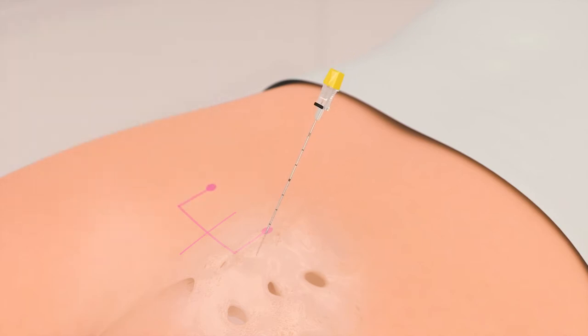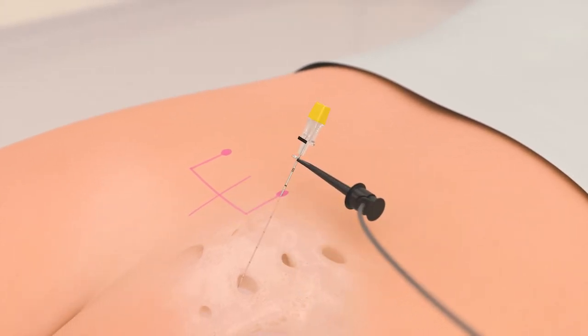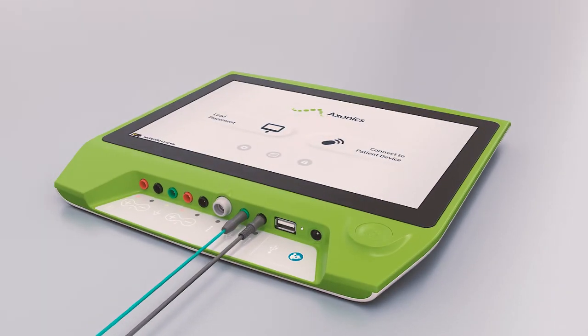Once the foramen is accessed, advance the foramen needle slightly. The needle test stimulation cable is clipped to the uninsulated portion of the foramen needle. The other end is connected to the clinician programmer.